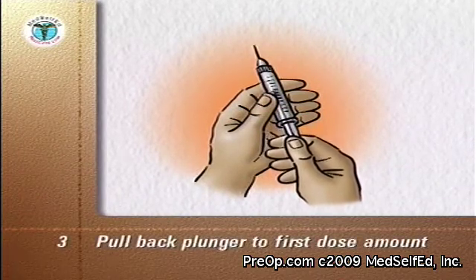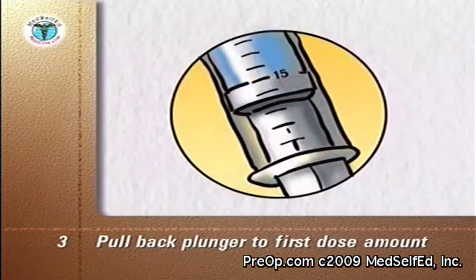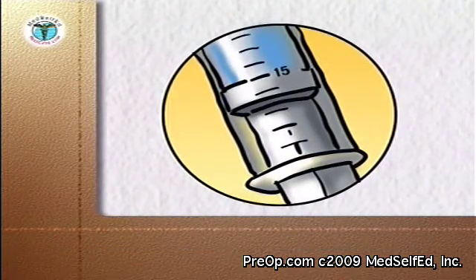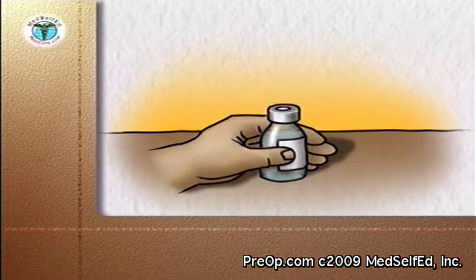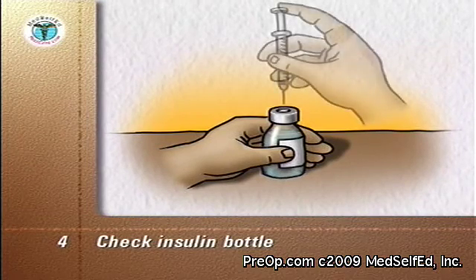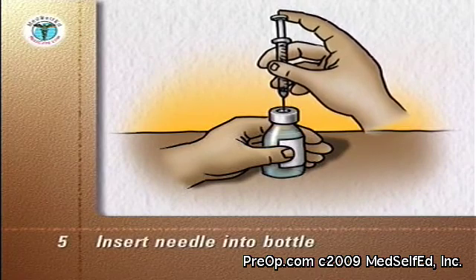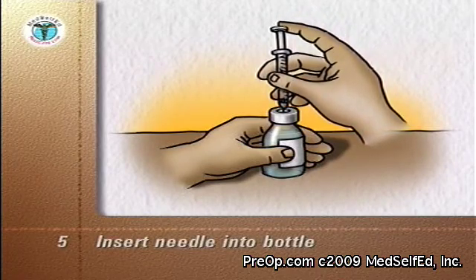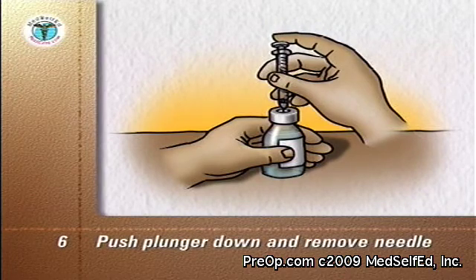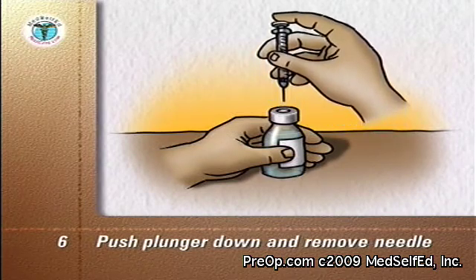Pull back the plunger of the syringe to the dose of the long-acting cloudy insulin — in this example, 15 units. You now have 15 units of air in the syringe. Check the insulin bottle to ensure you have the correct cloudy type of insulin. With the insulin bottle held firmly on a counter or tabletop, insert the needle through the rubber cap into the bottle. Push the plunger down so that the air goes from the syringe into the bottle, then remove the needle and syringe. This primes the bottle for when you withdraw the insulin later.